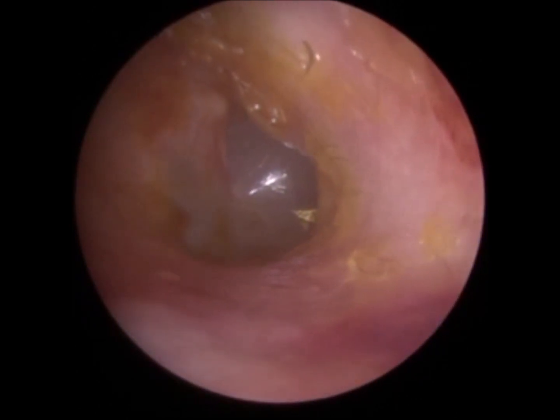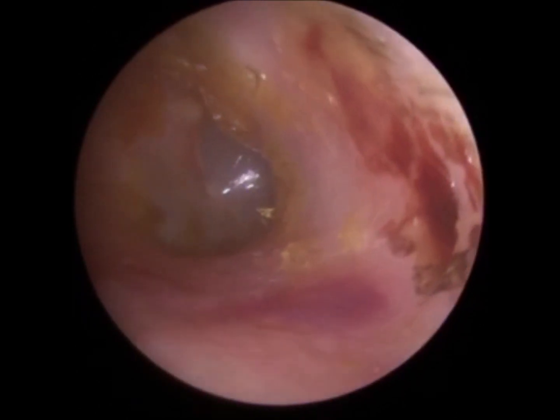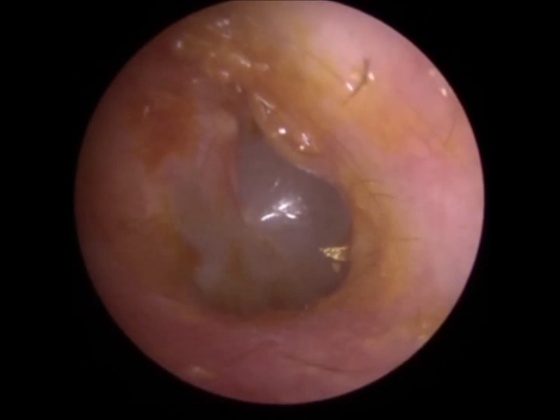I'm going to leave the rest of that because the ears are really bruised and I don't want to add more trauma. There's a bit of wax left on the canal wall — the bony part.